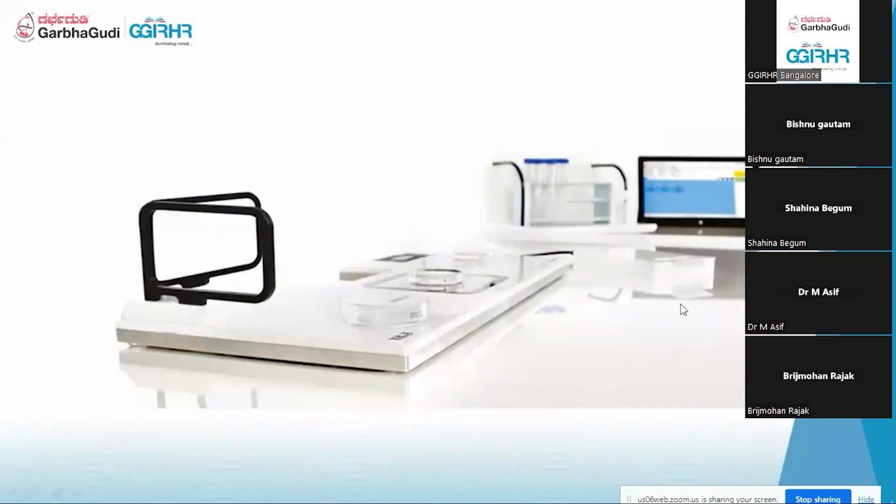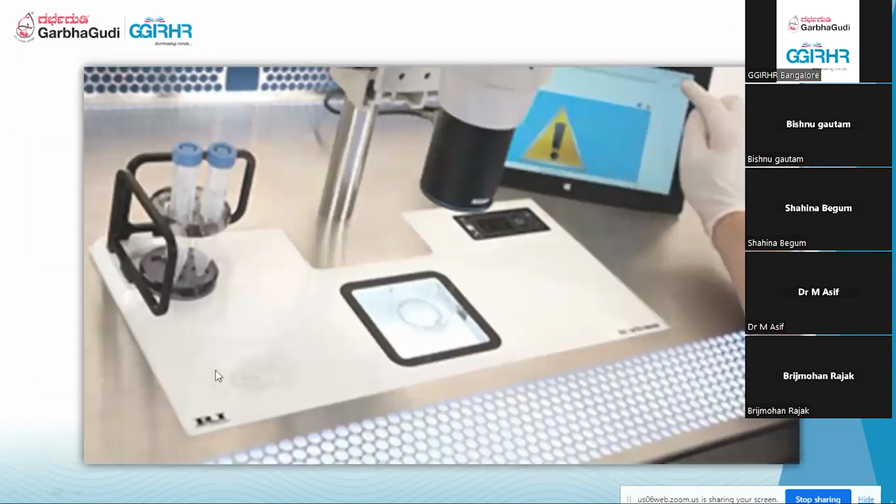Now, important. What is the RI witnessing system? Can you see here? This is the hardware, where we can place 5 dishes. I'll show you in brief. This is the hardware of the RI witnessing system. It can be placed on the workstation, where we can place 5 dishes of the same patient. And this is a stereo microscope.